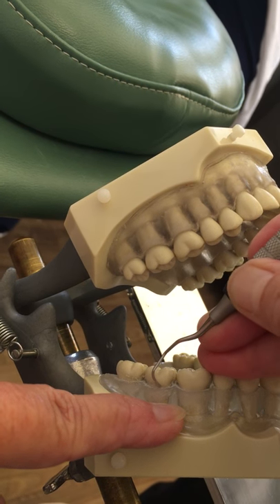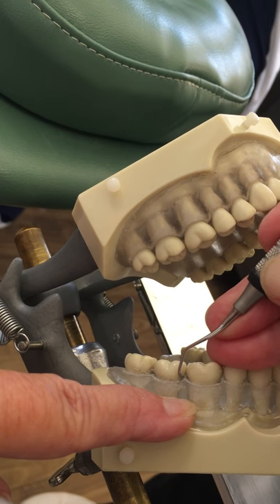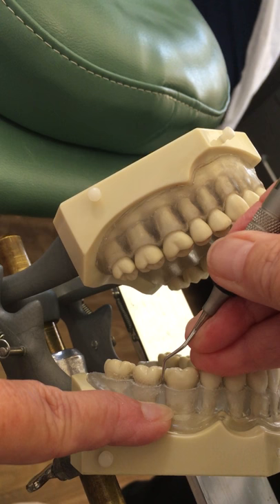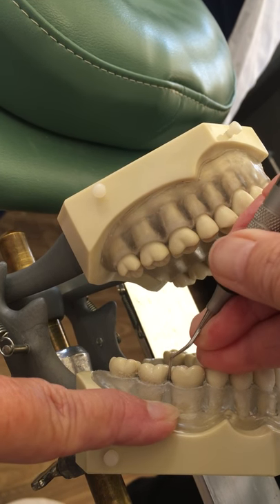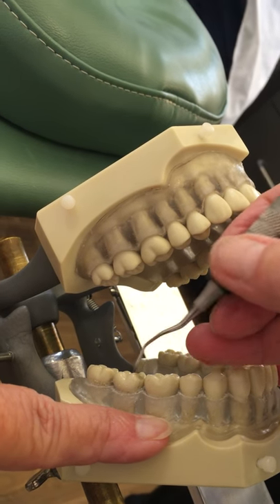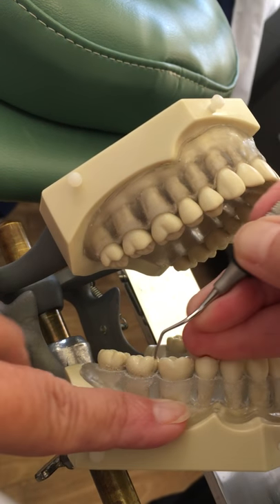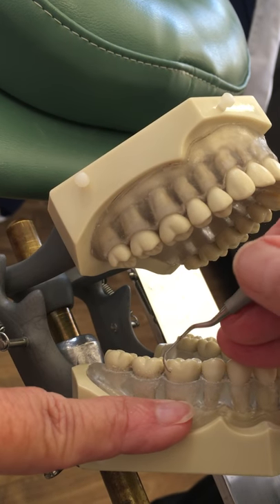I'm using oblique strokes across the buccal, and then as I come around the mesial, I'll be using vertical strokes. I stopped, took it out, and went back to the mesial — so I had to insert closed and then open when I started over, because I didn't know exactly where I stopped. I wanted to go back in closed to explore the area.